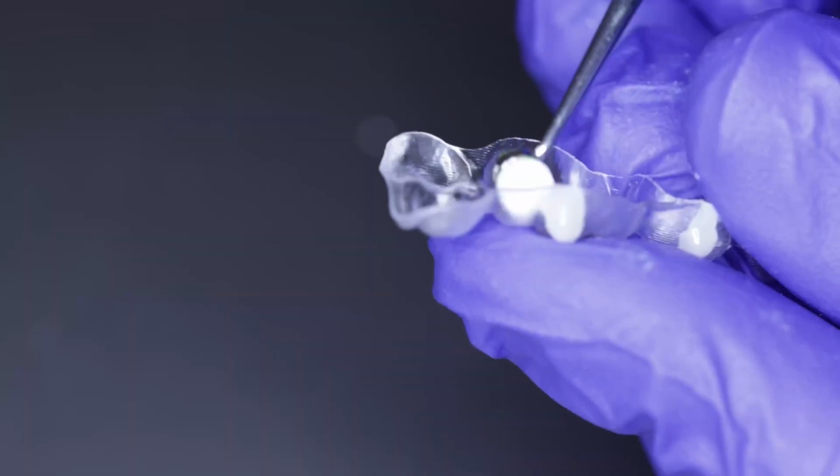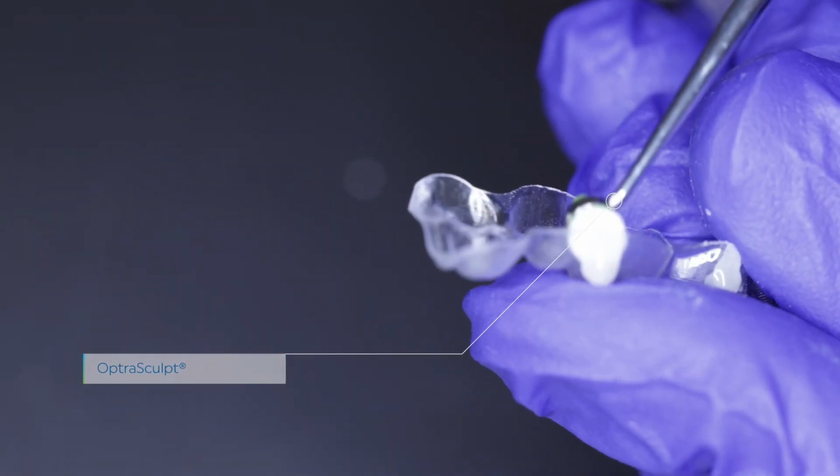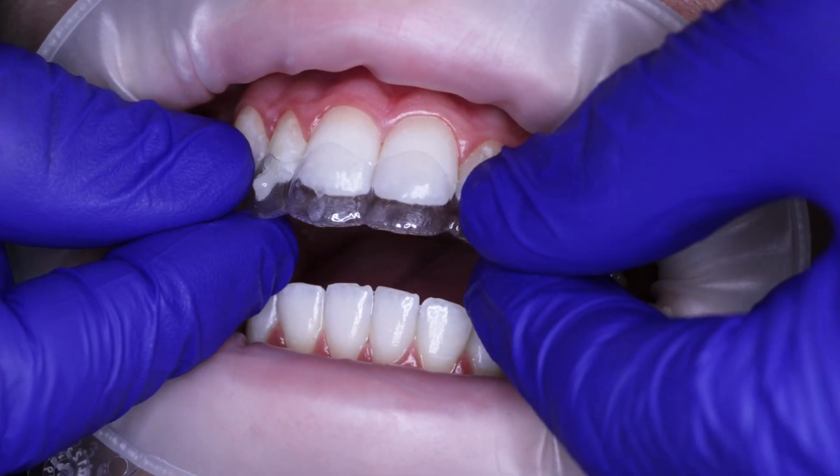Now I'm going to go to my Tetric. Now I told you I like to preload. After I've done my try-in for my template and my first aligner, I will preload this and put it into the Prepster. Here you'll see I've done that. I've got all of my material.